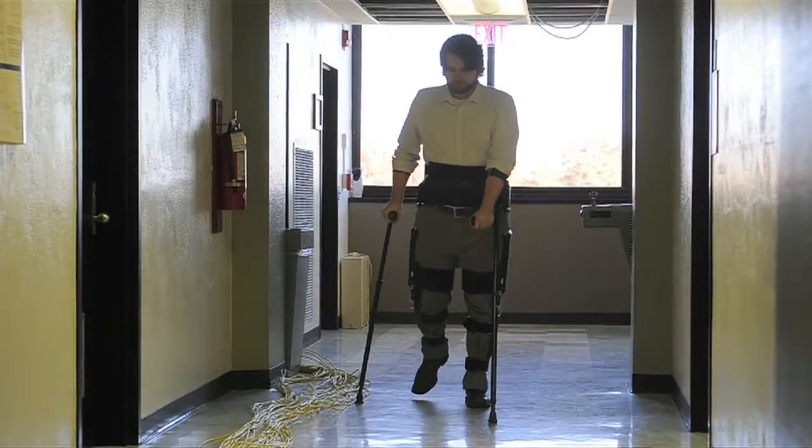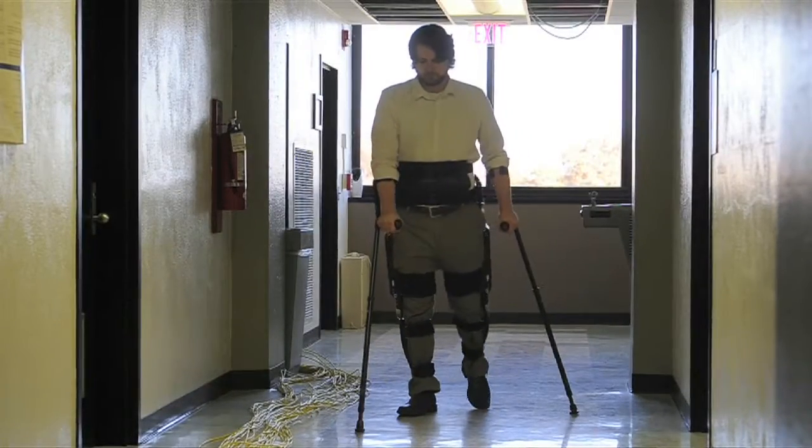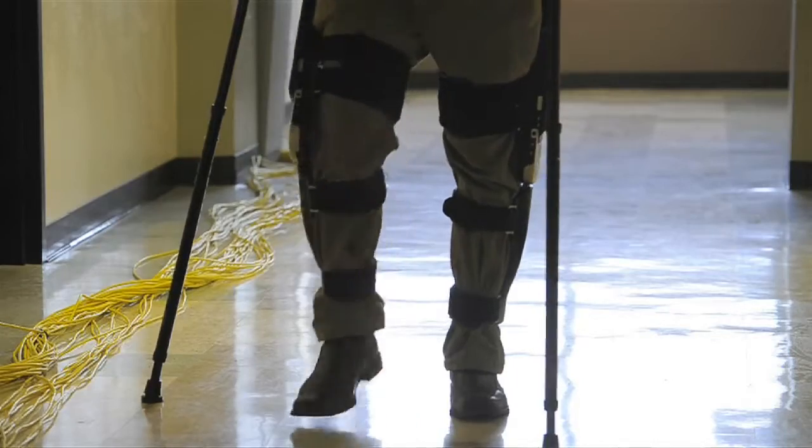This is intended to give people freedom from their chair. It is intended to enable them to more fully participate in life. There are a lot of places that people in wheelchairs can't go.